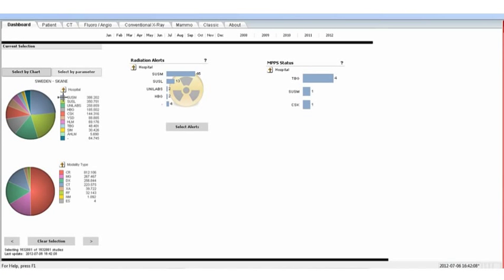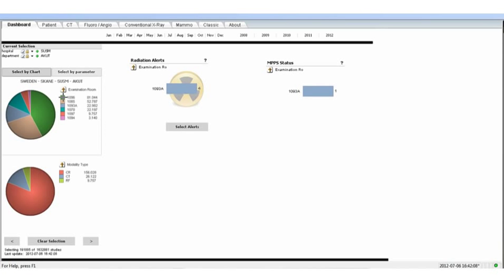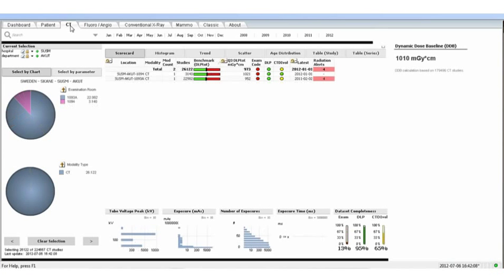Another key element of functionality of the system is the ability to drill into the data within a specific organization. We can choose the hospital within our organization by pressing the button on the screen, and then we can drill into the sub-departments within that organization with another simple key press. To identify the CT scanners within the accident and emergency department, we can then press the CT button and this shows us our two CT scanners in use.